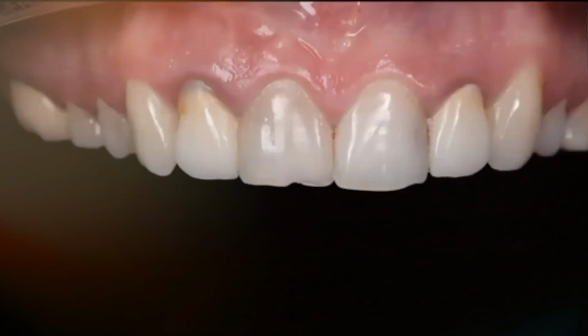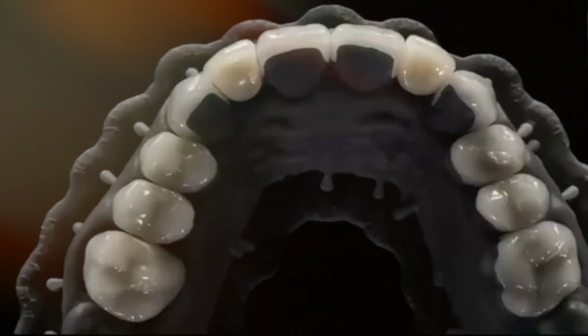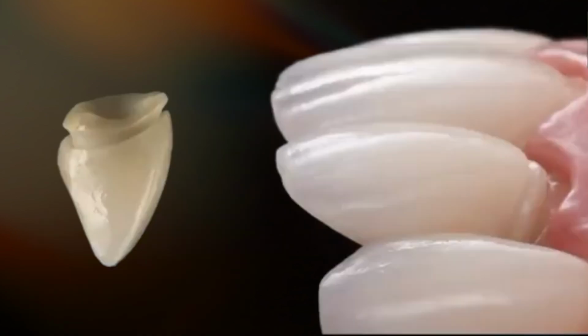Now, another option here is coping. This is easier for the dentist because the dentist just has to prep more. So here we have two laterals, and in these two laterals we're going to prep more, and we're going to mill a crown and coping. And you can see how it looks. The coping, you can make it Emax, you can make it zirconia, and they're going to be bonded together in the lab. Okay, and then you receive one crown that will block.